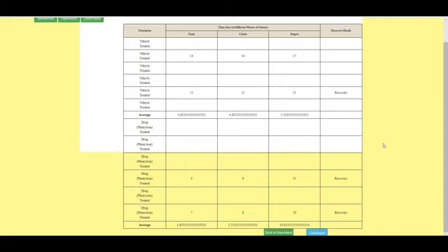Which means the seizure exists for a shorter duration because we are using the anticonvulsant, anti-seizure or anti-epileptic drug. Thereby we can say that PHENYTOIN shows a very good effect on application to the animals with convulsant activity, by the MES method.